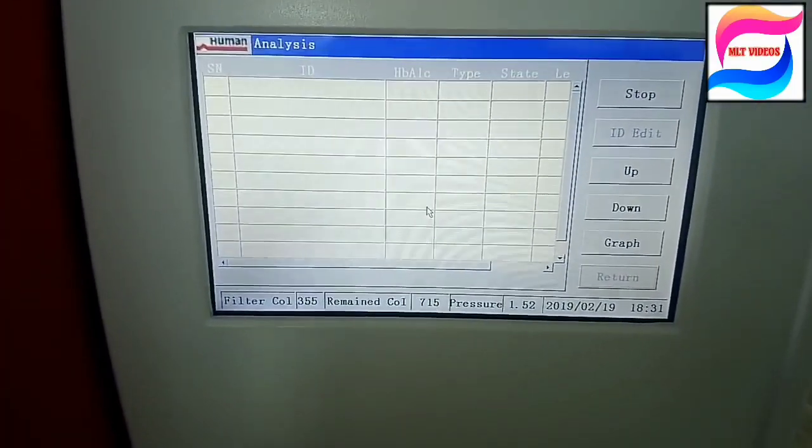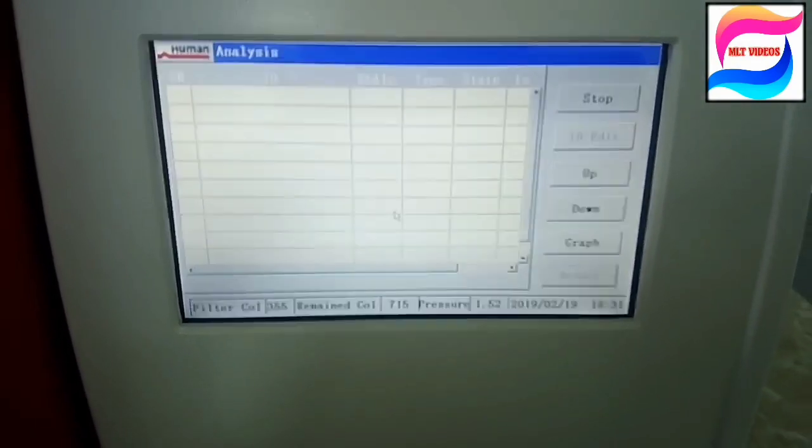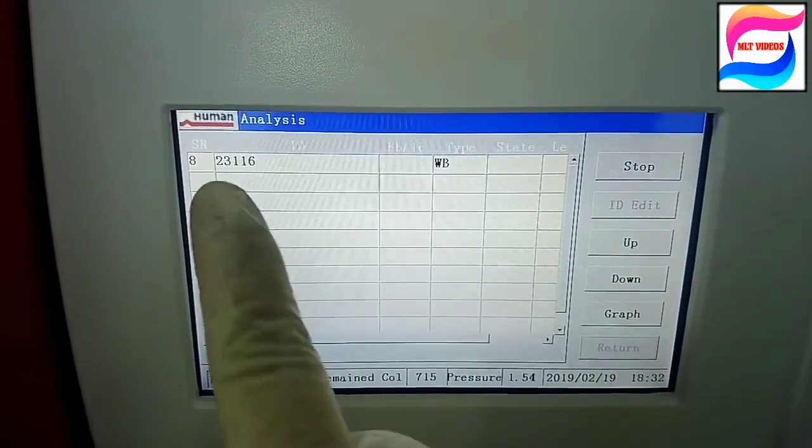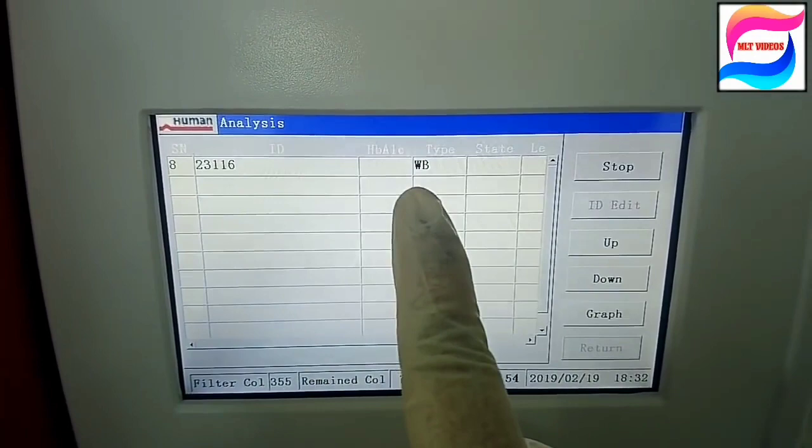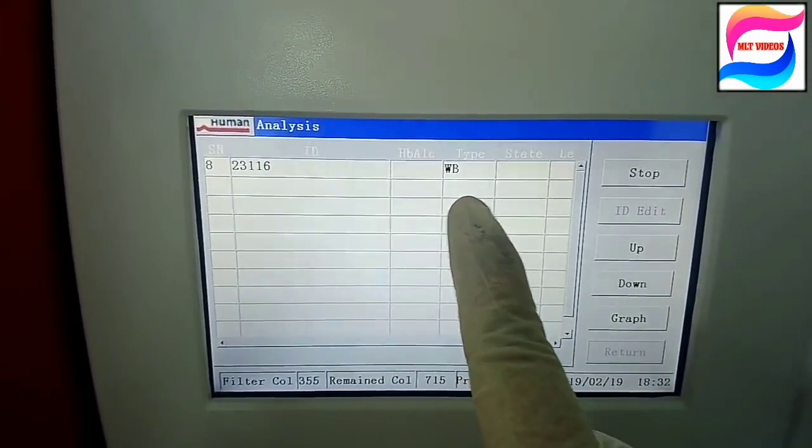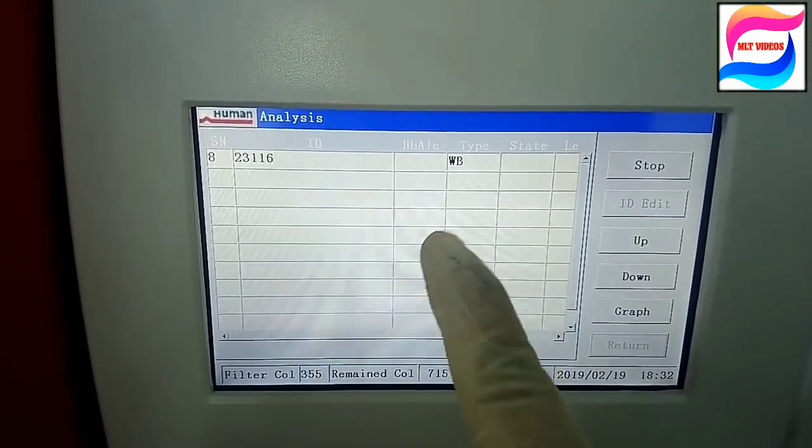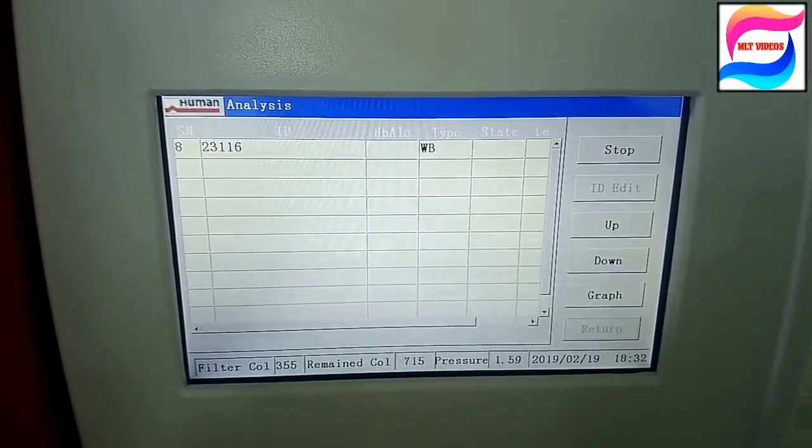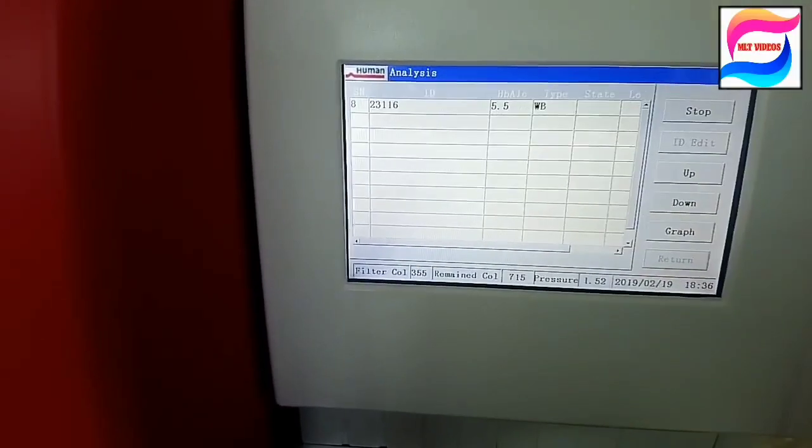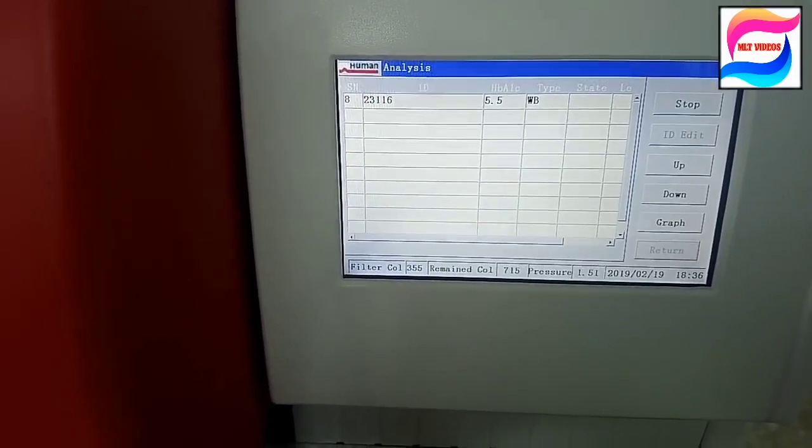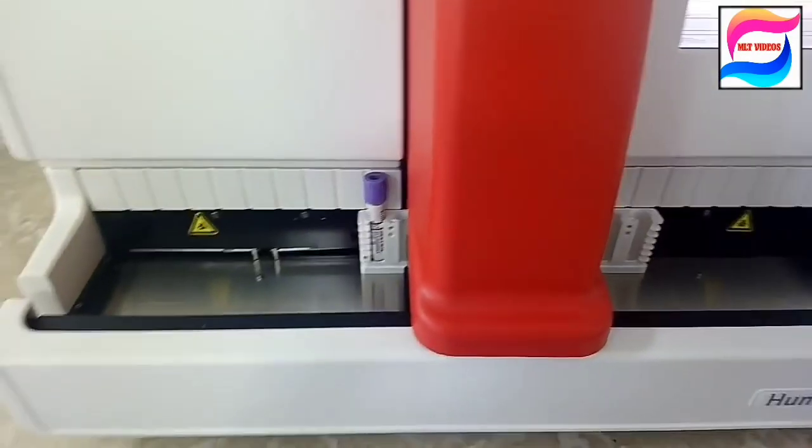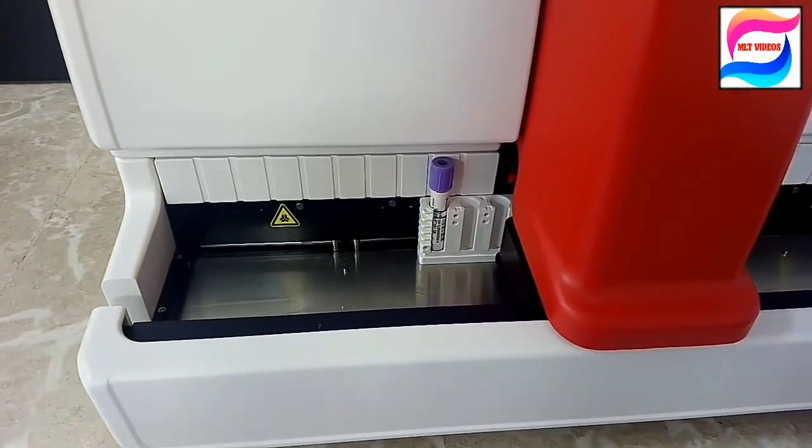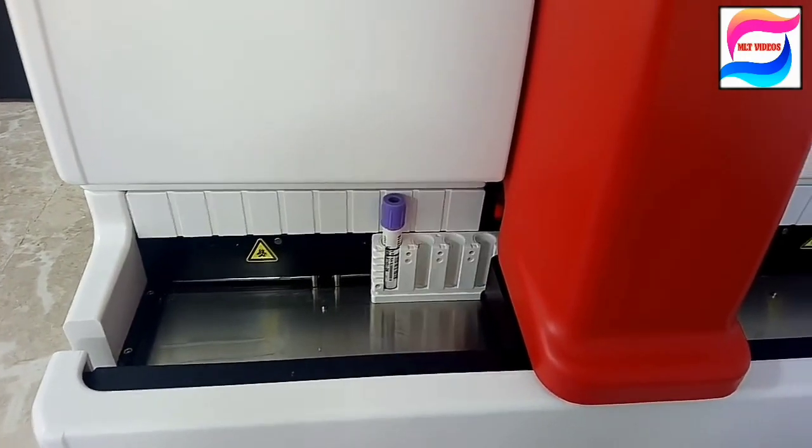Like this sample will go for running. See, machine read the barcode and machine also read the type of sample that it is whole blood. If it is diluted sample then also it will come. And after the result will come and like that tray rack will come out from other side.